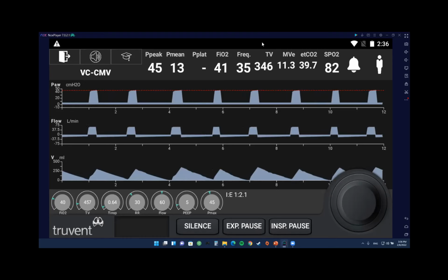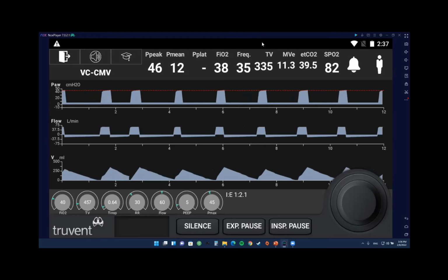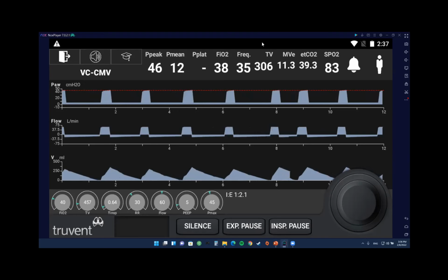I think we said that when the pressure is high, you want to first look for any type of obstruction. Is the patient biting on the tube? Could there be secretions that we need to suction and see if that improves? Versus something changing acutely with the compliance of the lung, which we would assess after ruling out.